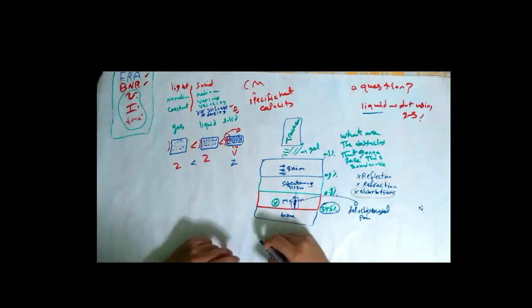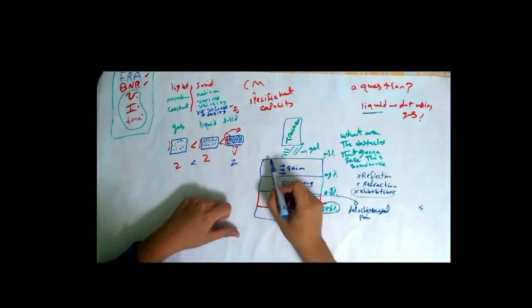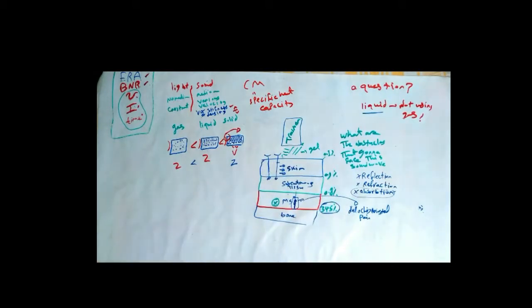Since I told you in the first part that absorption depends on the frequency that I use, 1 MHz has high diffraction and divergence, so it can preserve its energy. This means that, for example, if I have 1 MHz and 3 MHz waves propagating through skin, 3 MHz will lose most of its energy to the skin, while 1 MHz will preserve most of its energy through skin.